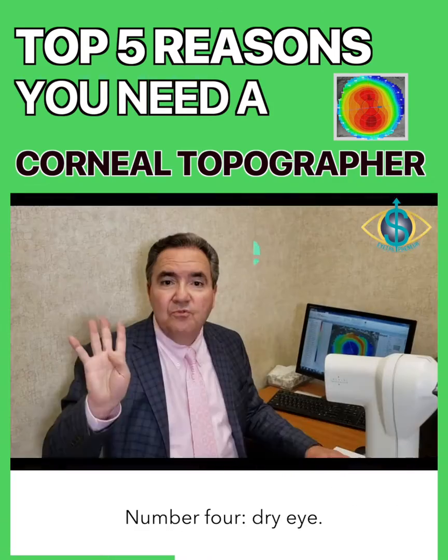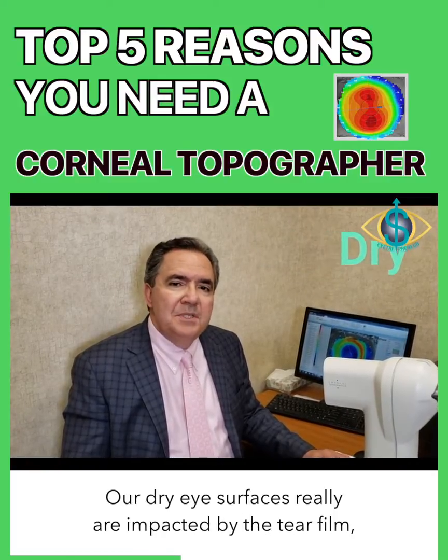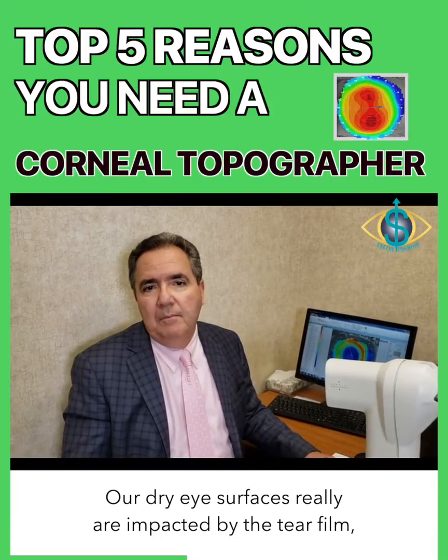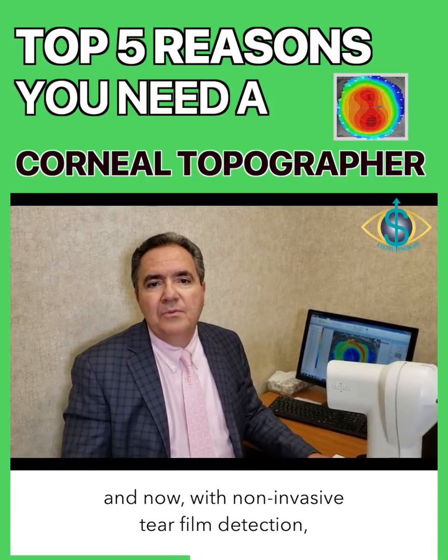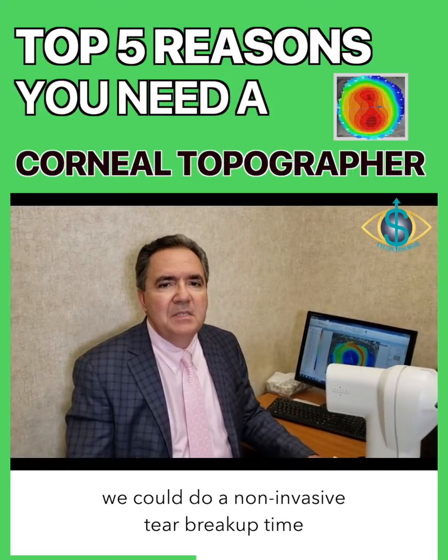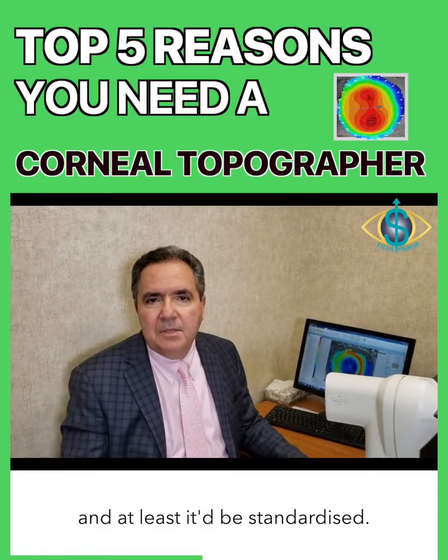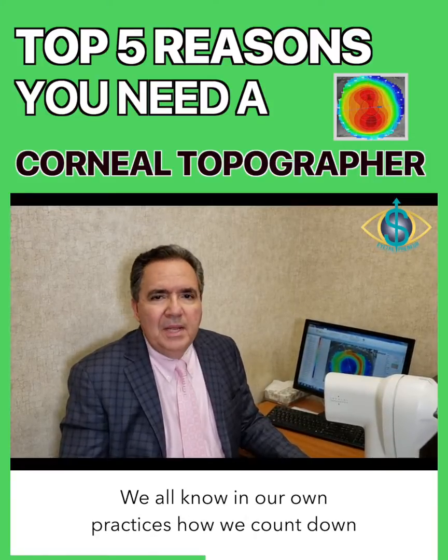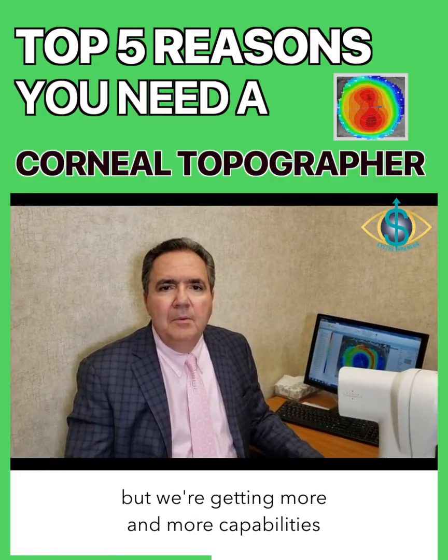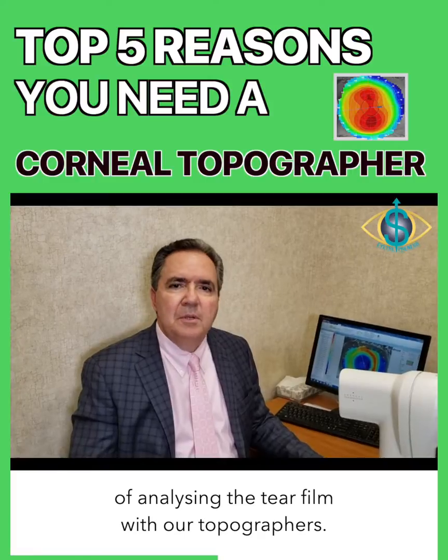Number 4, dry eye. Our dry eye surfaces really are impacted by the tear film. And now with non-invasive tear film detection, we could do a non-invasive tear breakup time, and at least it'd be standardized. We all know in our own practices how we count down for how long the tear film will be stable, but we're getting more and more capabilities of analyzing the tear film with our topographers.